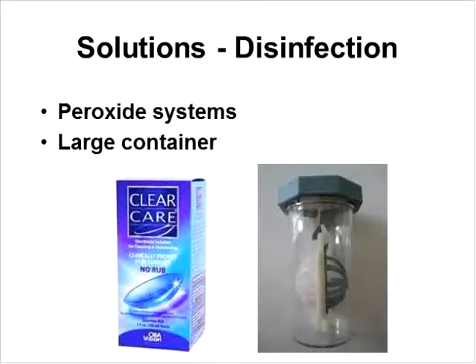Dr. Johns mentioned treatment for debris under the scleral lens. Do you recommend the same treatment for a standard keratoconic patient who does not have dry eye? I.e., is it still an issue of steepening the peripheral curves?